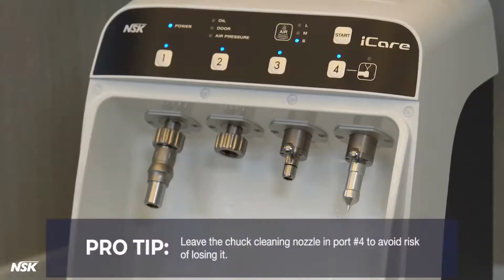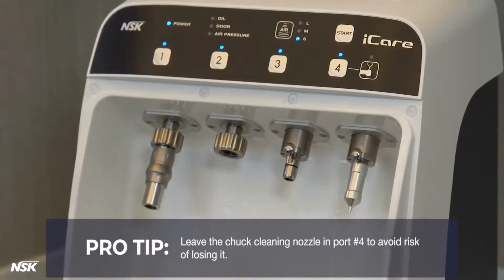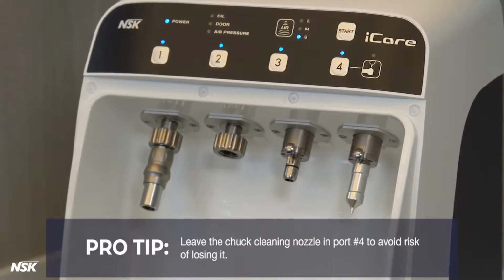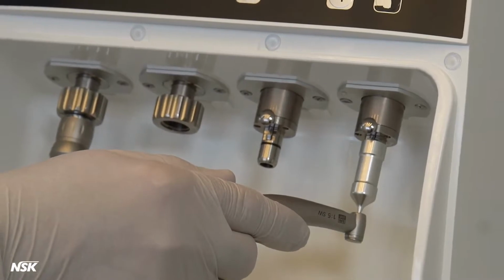Pro tip: it is recommended to leave the chuck cleaning nozzle in port number 4 to avoid risk of losing it or missing the chuck cleaning. It also keeps the cleaning process top of mind. It is recommended to perform chuck cleaning several times per week.